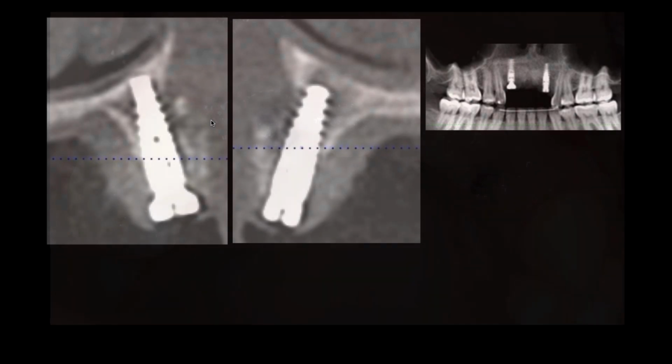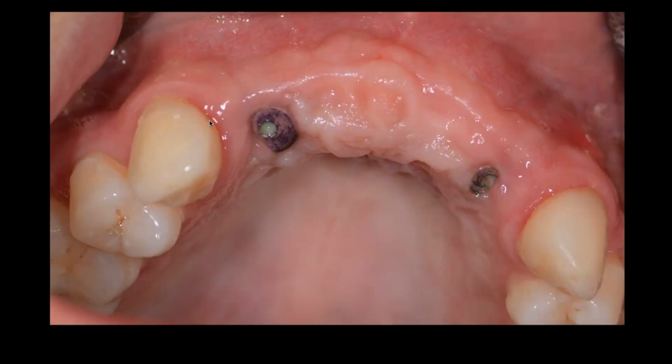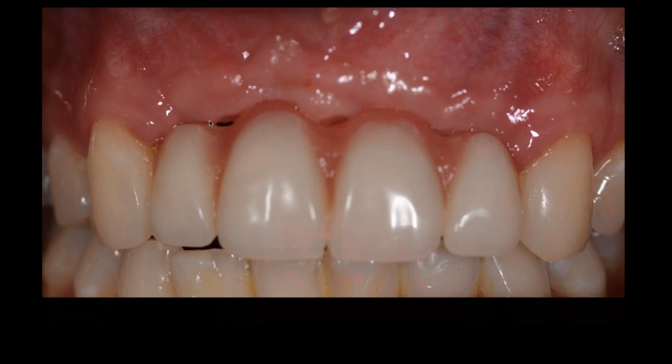It's very efficient. Now, when you see her healing after 4 months, look at the ridge and the curvature. You're starting to see this is starting to look much better now. Remember what she started with. So at this point, we've got something we can work with. So now I tested and sent her up to my buddy, and he went ahead and made her a screw retain temporary. Basically took the flipper and changed it out.